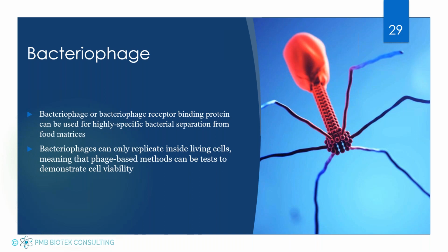If we put bacteriophage in there, and they infect those 3,000 cells, well, during that incubation phase where the bacteriophage is in there, that 3,000 can become 3 million pretty quickly because it's an nth degree replication. They infect the cell and then they multiply rapidly in the cell before they burst. So one phage may produce 100 new phages with each cell they infect. So we're able to rapidly increase it. You tend to sometimes see a little bit of cross-reactivity, so that is the downside to bacteriophage.